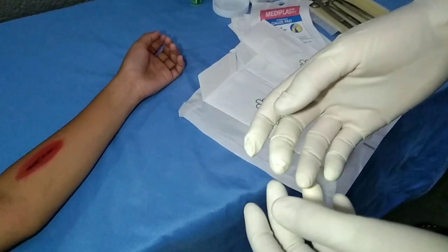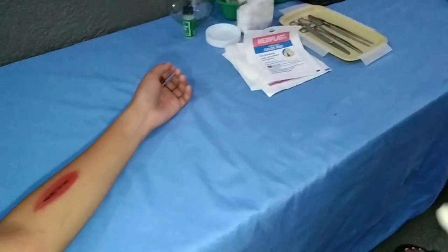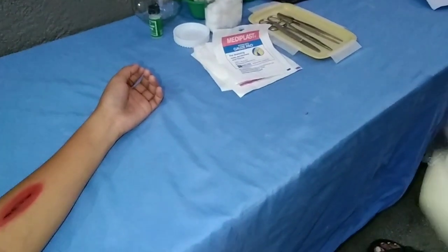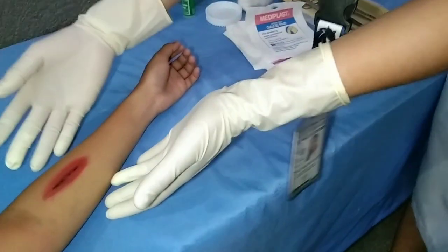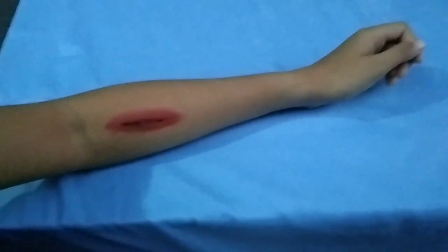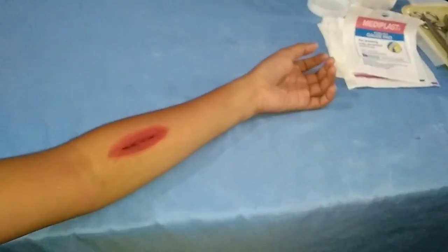Then after that, discard. And then next is assess the appearance of the tissues in and around the wound and the drainage. Okay, assess the tissues. And the next is clean the wound.